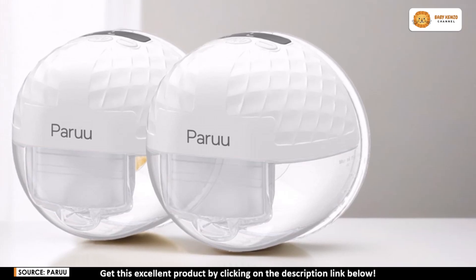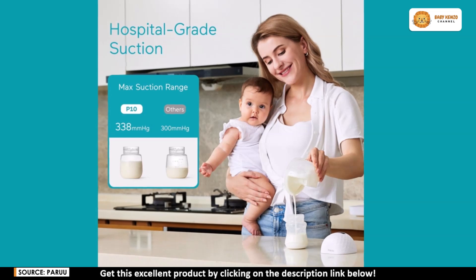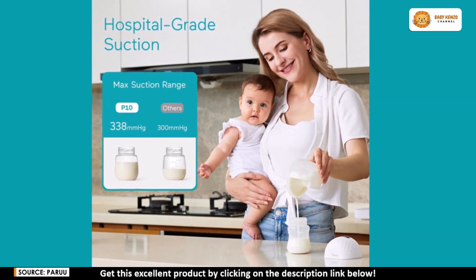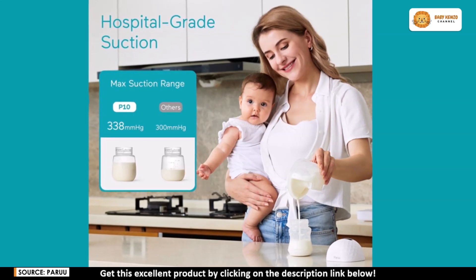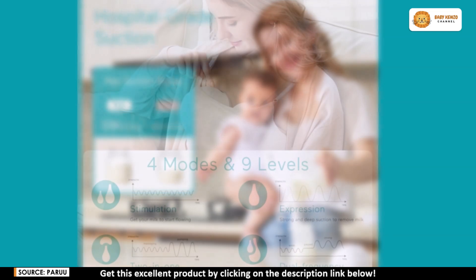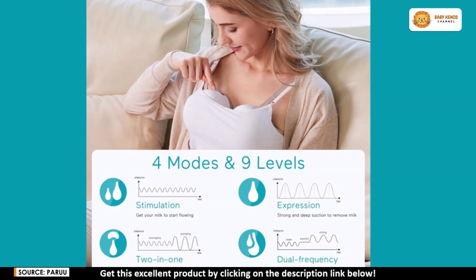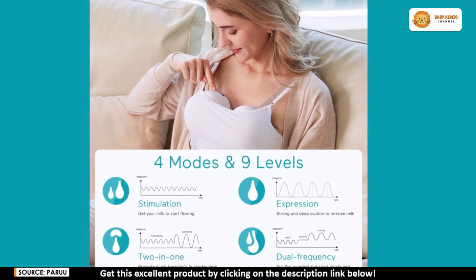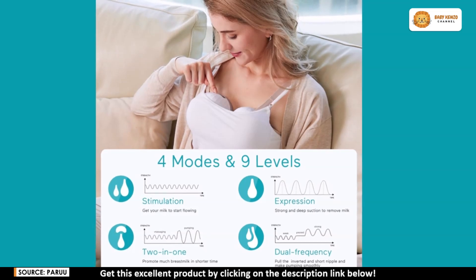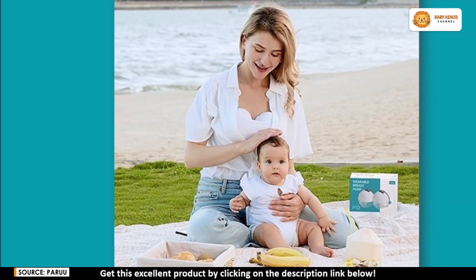The Paruu P10 offers impressive hospital-grade suction power reaching up to 338 mmHg for efficient milk expression. The pump also lets moms customize their pumping experience with four different modes and nine suction levels, allowing each mom to find the perfect balance of comfort and output. The dual frequency mode is especially helpful for moms with flat or inverted nipples, making the entire process smooth and stress-free.